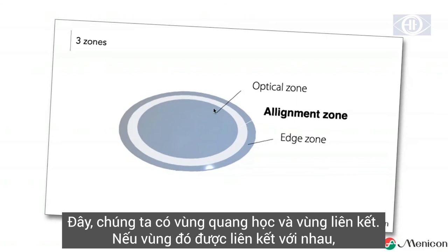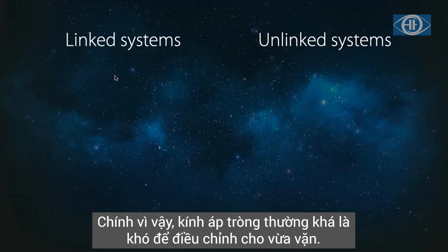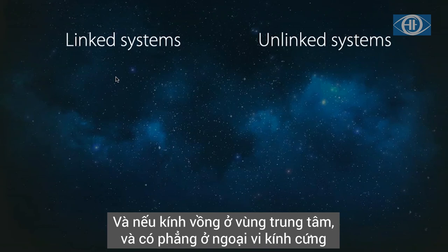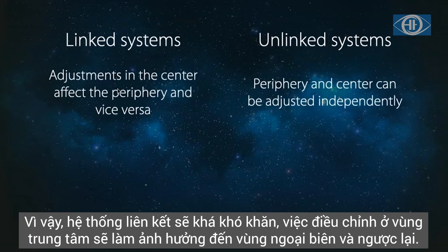If that part is linked, you can imagine that when you change the base curve of the lens, the periphery will change as well. That's what makes these lenses sometimes hard to fit, because if you have a steep fit in the center and a flat fit in the periphery with a GP lens, what are you going to do? If you steepen the lens for the periphery, you make it only steeper for the center area. And if you flatten it, you have a problem in the periphery. So a linked system is quite hard. Adjustments in the center affect the periphery and vice versa.